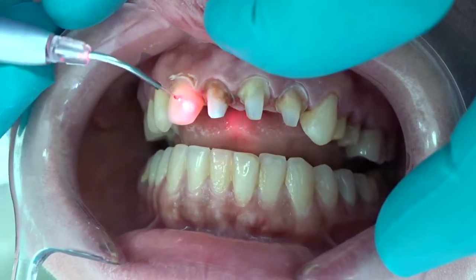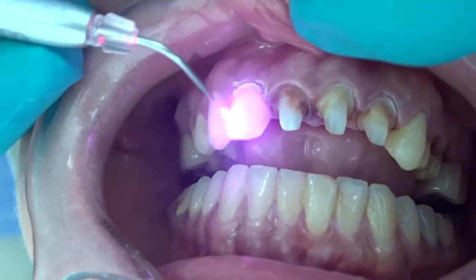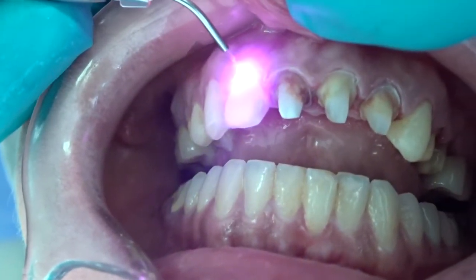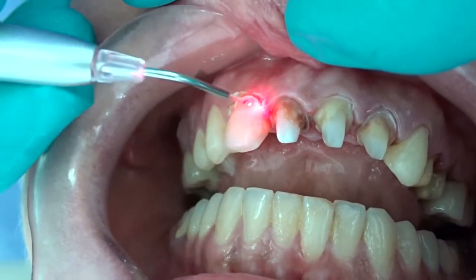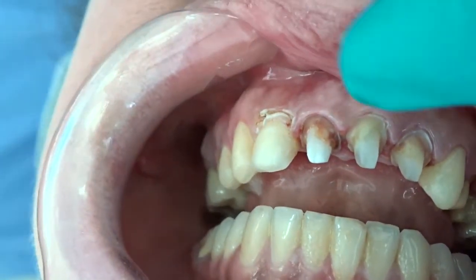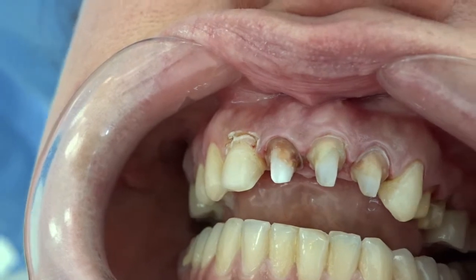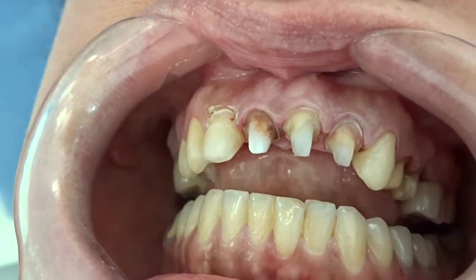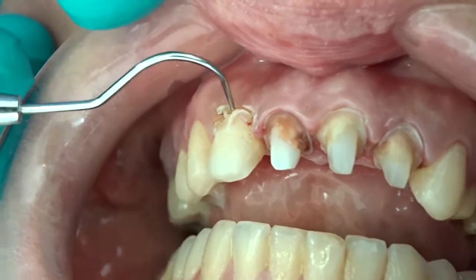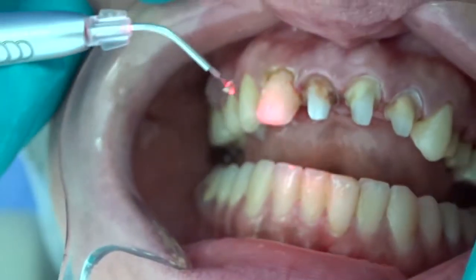It's very easy. You can use it in many treatments in dentistry, especially in gingivectomy. Now, after finishing the preparation of this case, I found that I need to edit my preparation. So I make gingivectomy within minutes.